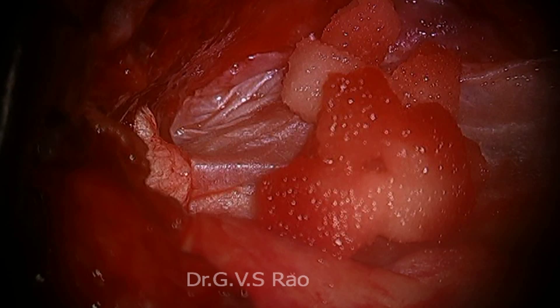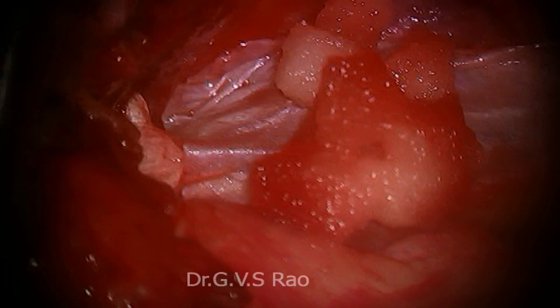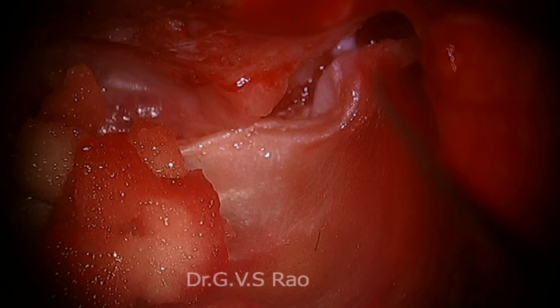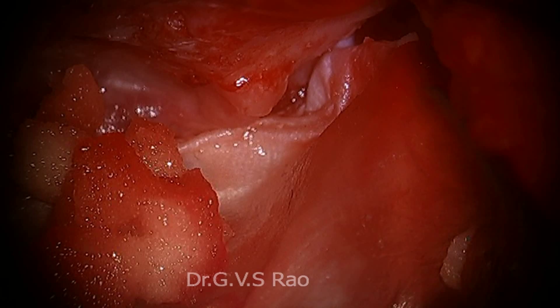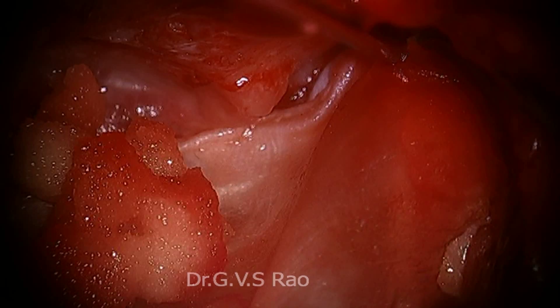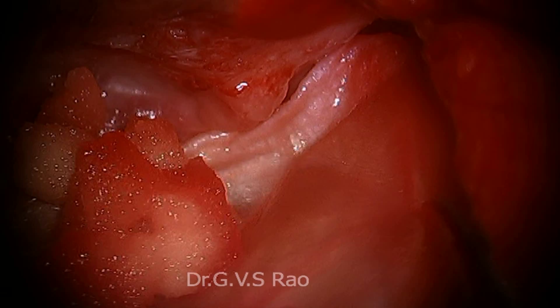Everything is fine. There is squamous epithelium — squamous epithelium is not covered with the temporalis fascia. Now you see, that is the reason the squamous epithelium is there. And here, this is the cartilage covered with the temporalis fascia. See — temporalis fascia — and I don't like that piece of cartilage getting exposed. That also I want to cover with the temporalis fascia.